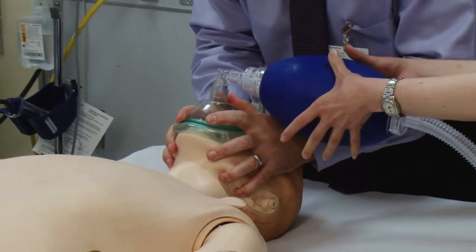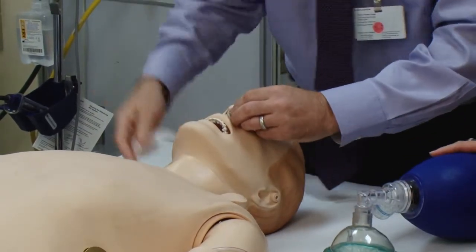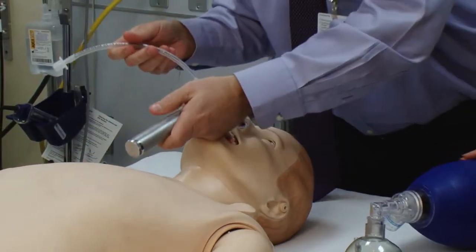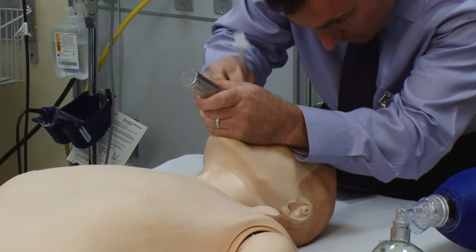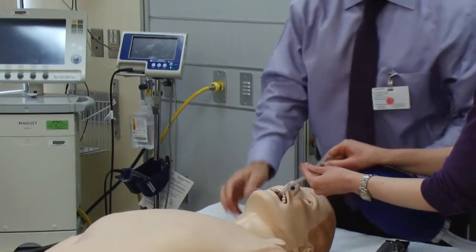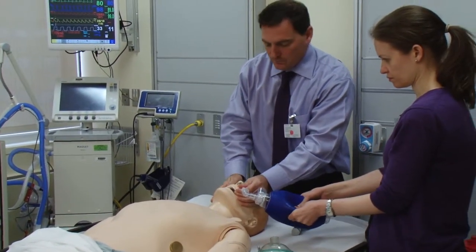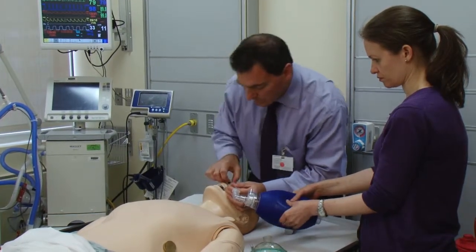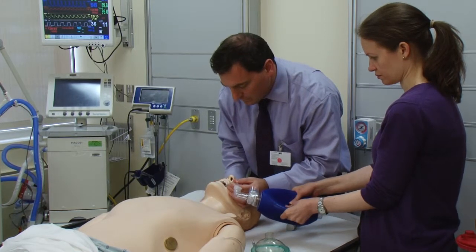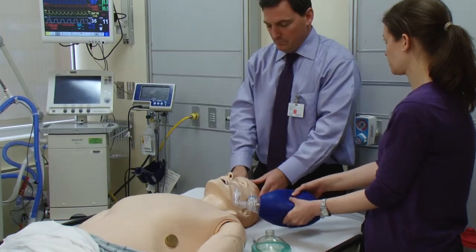When intubating the SimMan 3G, please use a size 6 ET tube, as this is less damaging to the internal structures of the mannequin. SimMan 3G is also able to recreate several airway complications, including mild or severe tongue edema, pharyngeal swelling, laryngospasm, decreased cervical range of motion, or trismus. If you feel resistance in the neck or find it difficult to pass an endotracheal tube, please do not force it. These are intentional clinical findings, and excessive pressure can damage the simulators. Airway lubricant will be available and must be sprayed on all tubes prior to insertion.